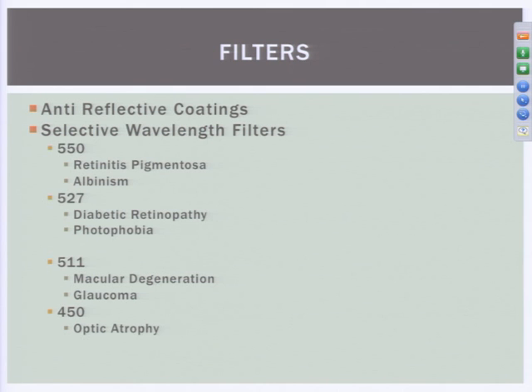You know from anybody who's used a hearing aid, you get a hearing test and they tune certain frequencies, the ones that you can't hear, and your hearing aid gets tuned to make the frequencies you can't hear louder and the frequencies you can hear normal. So in the same way, light has frequencies, and certain wavelengths of light confuse or otherwise create glare or uncomfortable vision for people with vision disease. So we use certain filters.